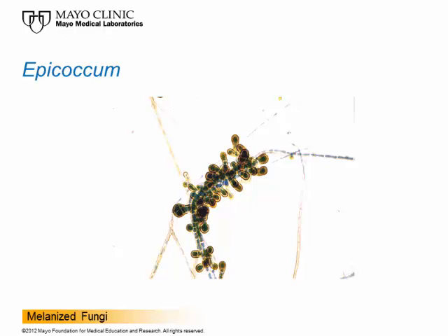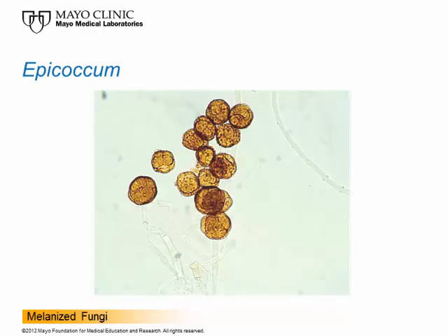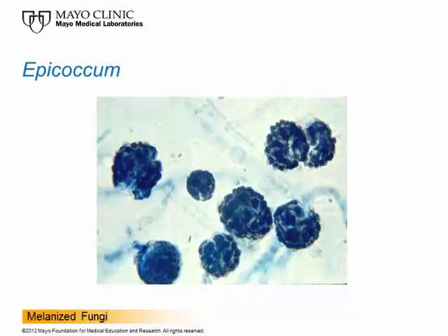In early growth of Epicoccum, you can see all the conidia being produced side by side, and after a while they form more and more, grouped together. The conidia themselves have horizontal and longitudinal septations. They may become dark brown and crusty-looking with rough walls, but you can still look and see the septations. The older, very mature ones clump together and get crusty-looking. But if you see a whole cluster of these in the sporodochium, you're going to know you're dealing with Epicoccum, and look for that orange diffusible pigment.